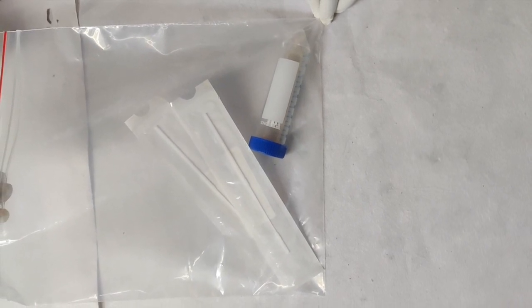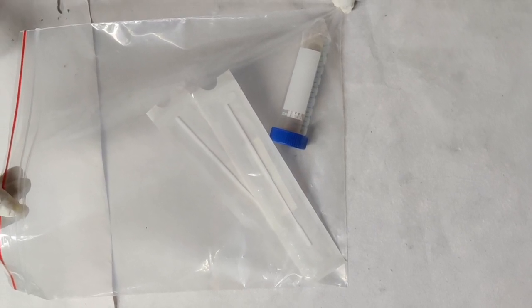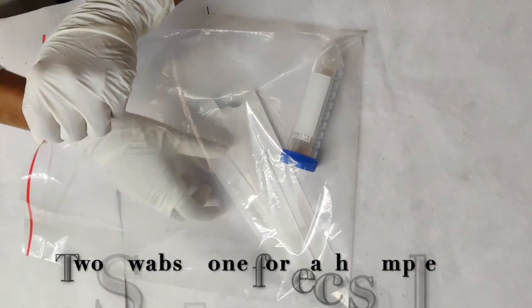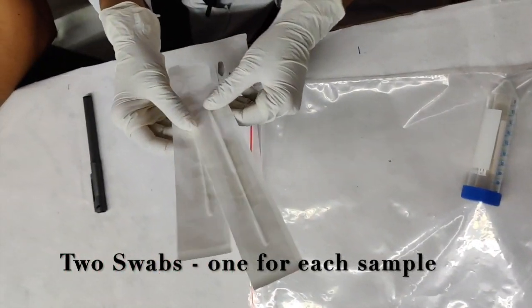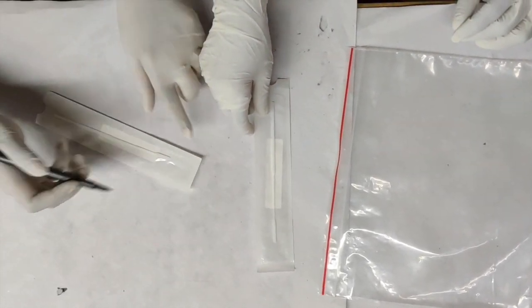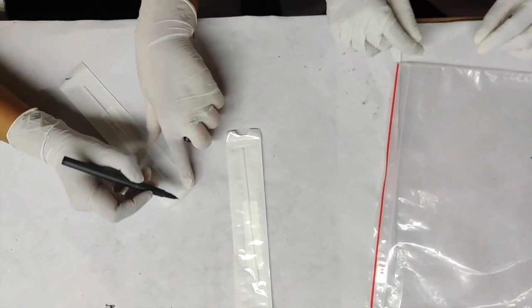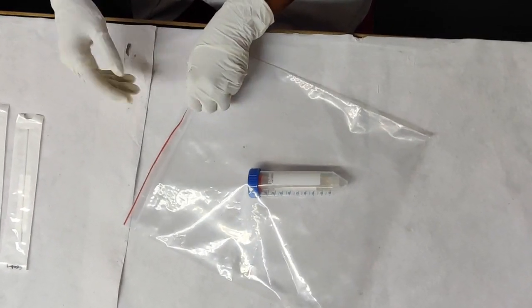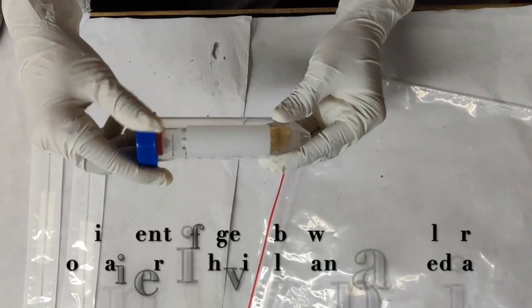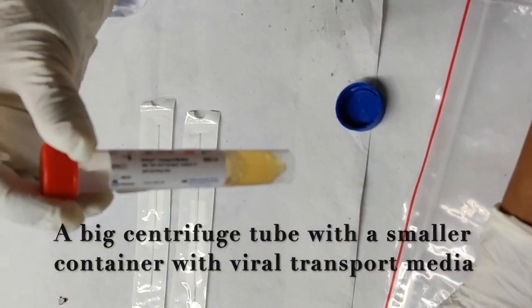Now we will be demonstrating how to send a sample to a microbiology lab. So these are the components of the kit which has been provided by the microbiology department to all the wards in our hospital. It has a Ziploc bag which has 2 swabs. One swab has been provided to collect the sample from the posterior wall of the pharynx. The second swab has been provided to collect the sample from both the nostrils. The other component which we have in this Ziploc bag is a bigger centrifuge tube. This bigger centrifuge tube has a small viral transport medium tube.